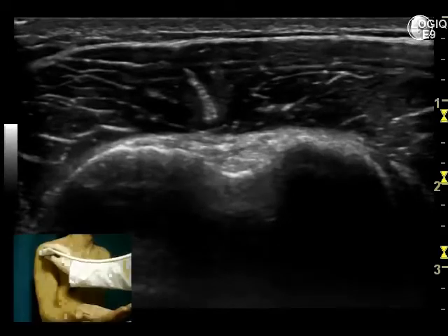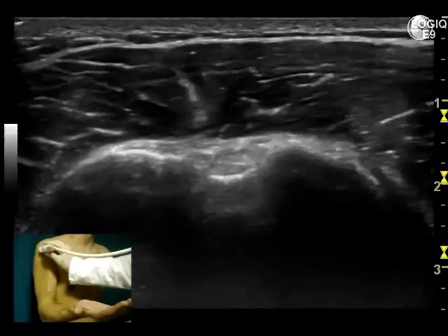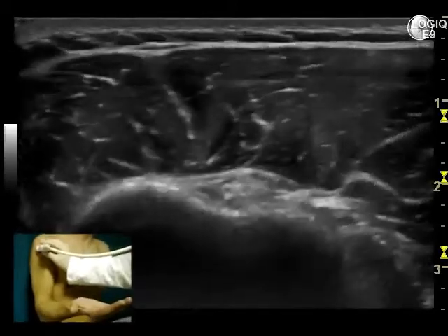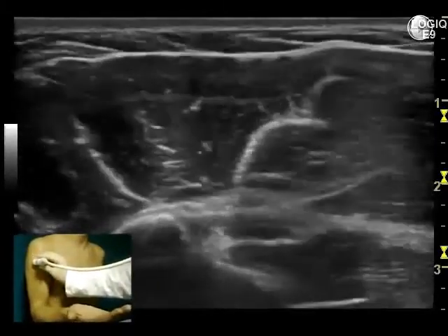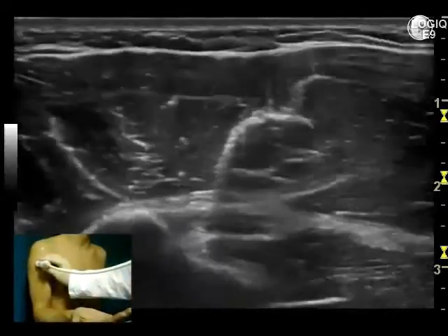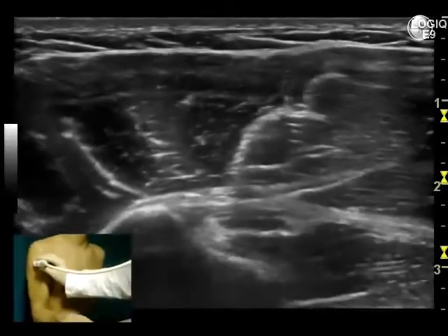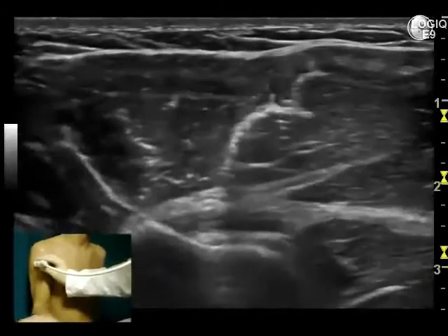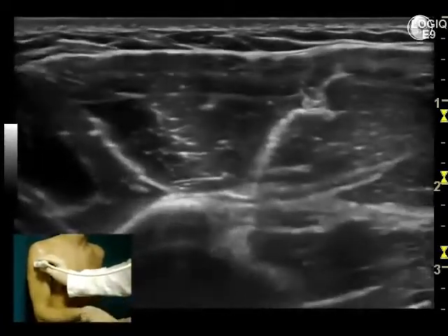Holding the transducer in a horizontal position, localize the bicipital groove on an axial plane. Then slide caudally to evaluate the vertical part of the long head of biceps tendon up to the myotendinous junction. At this level, the humeral insertion of the pectoralis major tendon can be seen, as best demonstrated with dynamic evaluation.